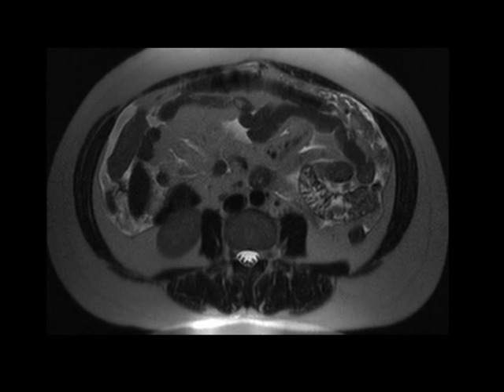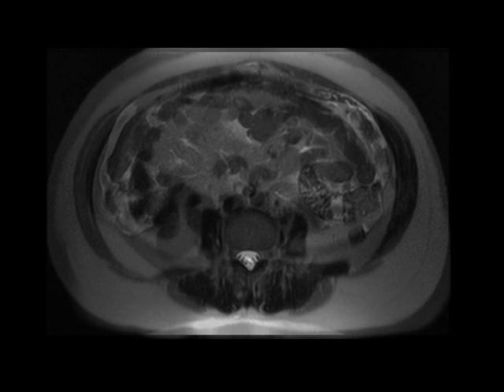Here's a good example of an entity that all too often is missed on MRI, but is much easier to appreciate on CT images. If you're not thinking about it when you're evaluating the MRI images, this is a diagnosis that you could easily miss.